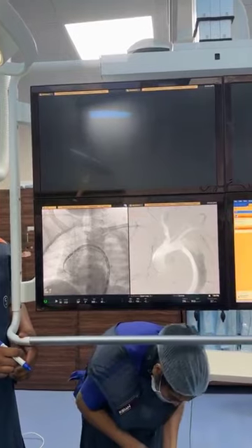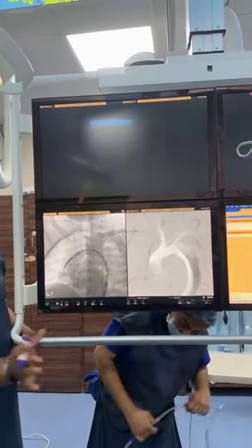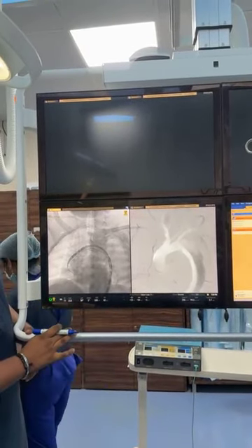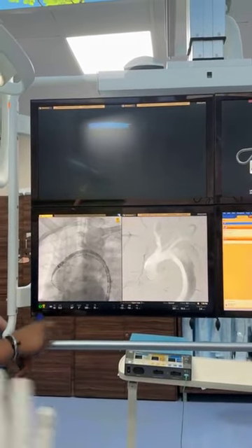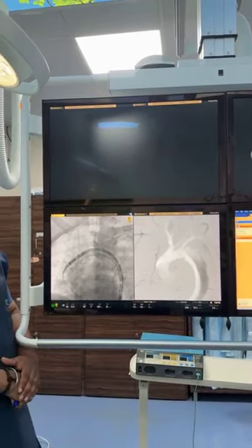No, I am reducing the blood pressure. That's most important for me right now. Table down. Just give me a mag. Wait a minute. Give me a mag. One more mag. Sunil, calm down. Okay? Coupling is off, sir.